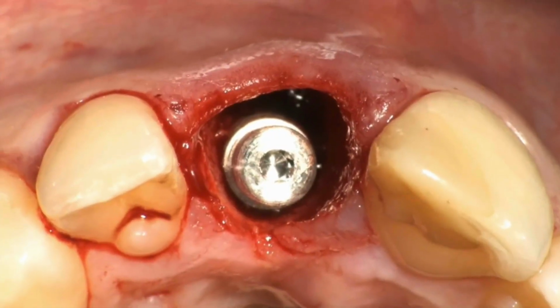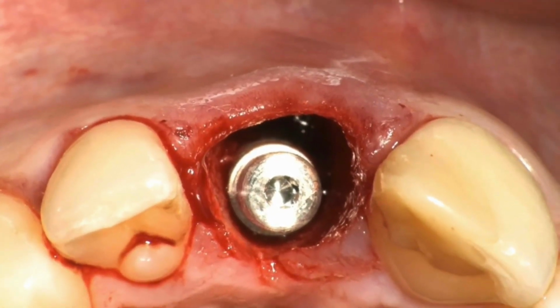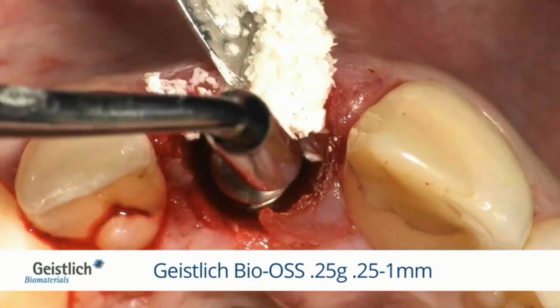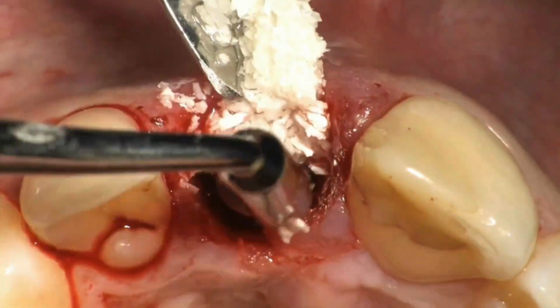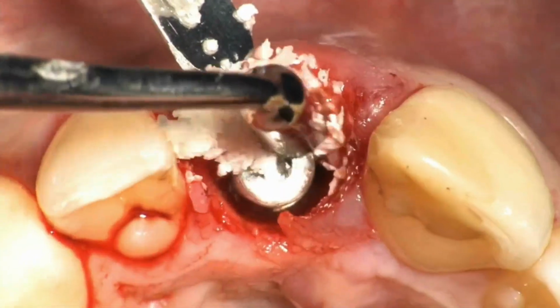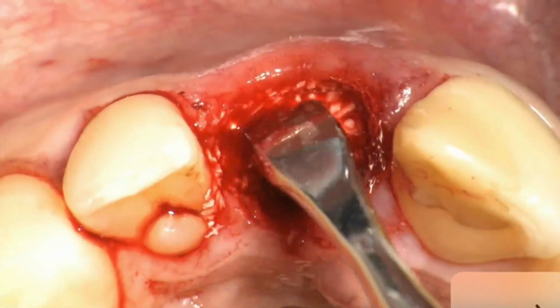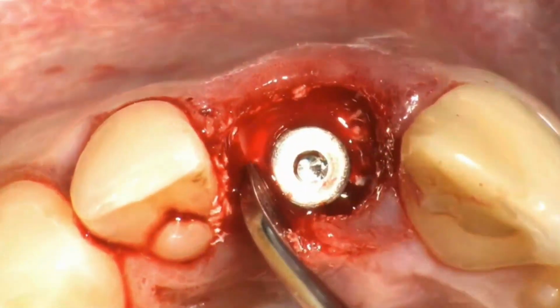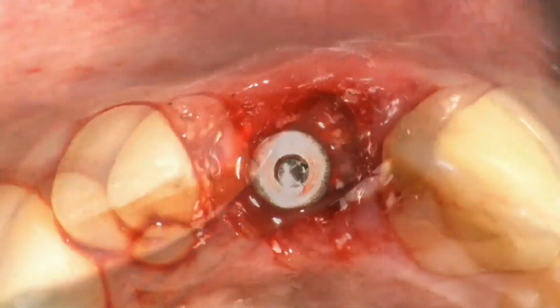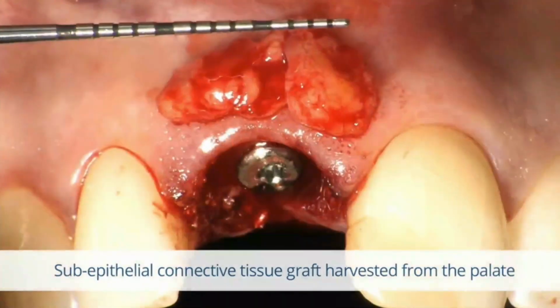You can see the gap between the buccal titanium surface and the buccal bone plate. This gets filled with a bone substitute because the buccal bone plate is intact. And you can see here how actually we have a nice condensation of that bone. Already it's soaking in with blood coming from the socket, so it's a really nice vascularization immediately.